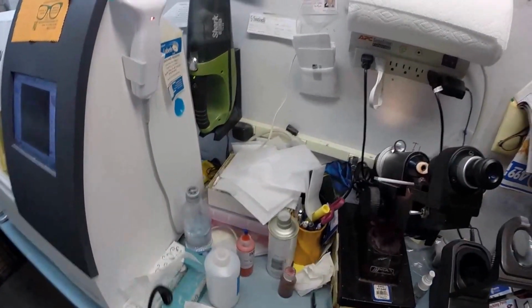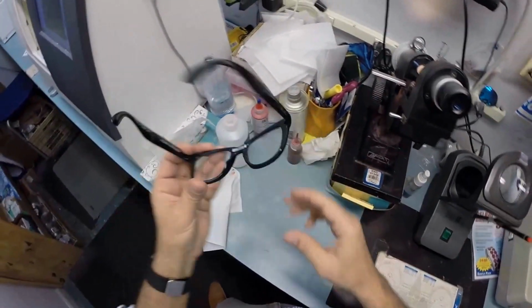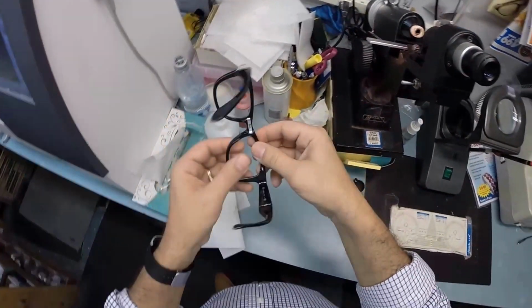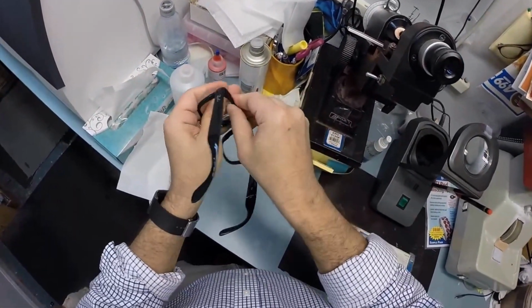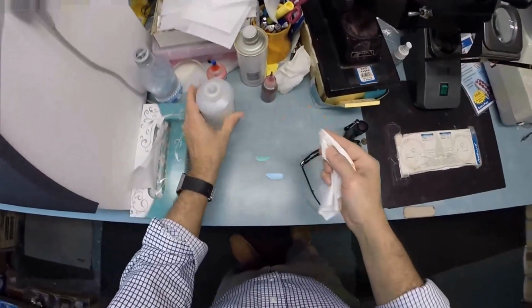Now, years from now, Ramiro, as you keep studying and as you get into med school, you may need lenses that are a little bit stronger. So you won't have to buy another frame. You can pop these lenses out, and I'm going to show you how now. But you just pull up on the top of the frame, and then with your thumbs you kind of just push outward. That's how you do that. Same thing on this side. And let me go ahead and clean those red dots off while I have them out here.